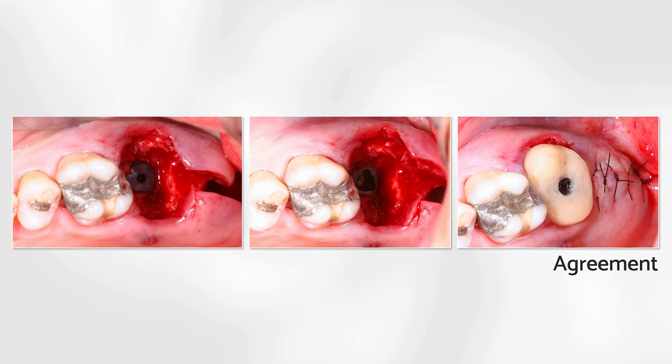When we insert the implant in the posterior zone, we should make an agreement with the patient. In this agreement, we should split the responsibility with the patient: 50% of the responsibility belongs to the patient and 50% belongs to us. And we have to explain to the patient how to follow this protocol, because if the patient doesn't obey the order and starts chewing or biting over the implant, we will fail. This is our job, to make this agreement with the patient before we do the surgery, especially when we intend to insert the implant in the posterior zone.